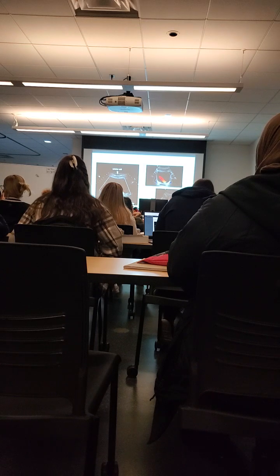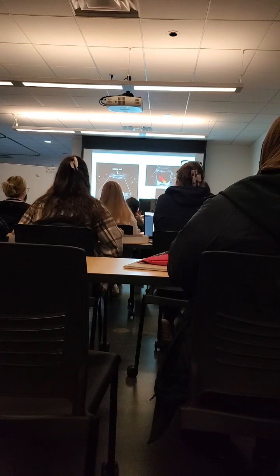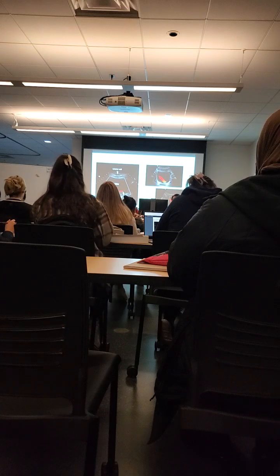And sometimes it's going to go, and it's pretty cool. So when you guys get to practice scanning, drink a bunch of water. It takes 40 minutes for water to go through the body, so don't expect yourself to drink water and then all of a sudden see jets. Any other questions? We know that this is anterior, posterior. So we're good. Right, left. All right.